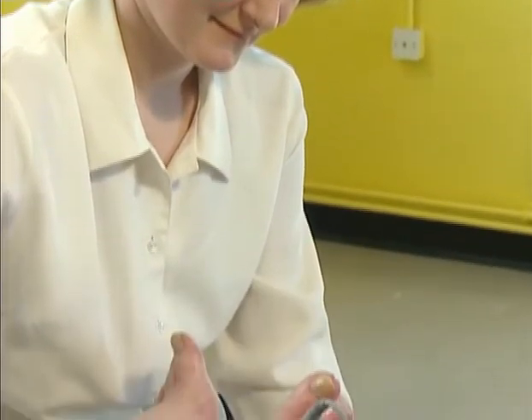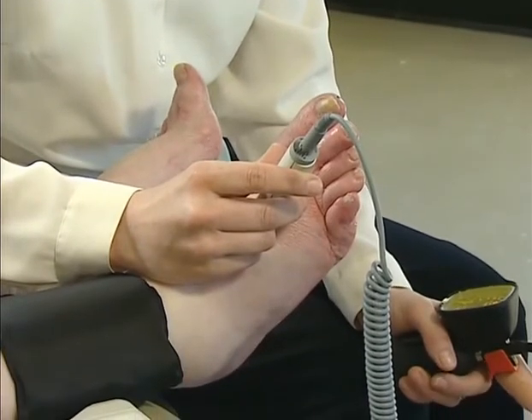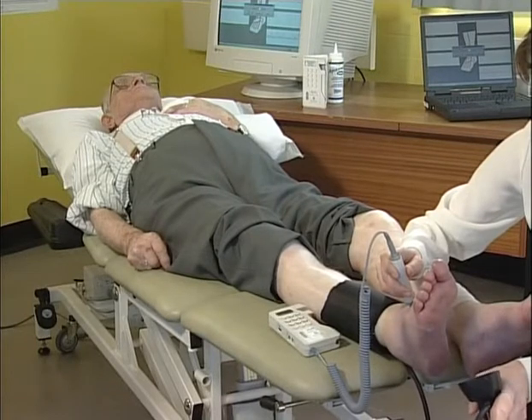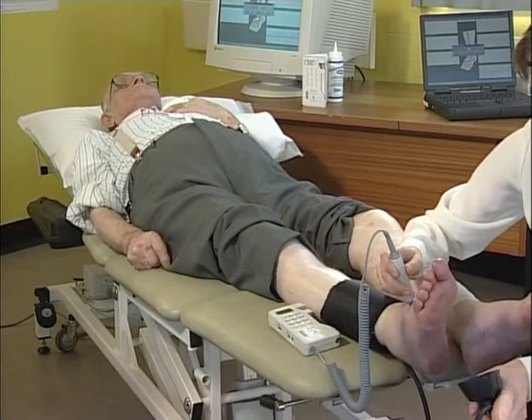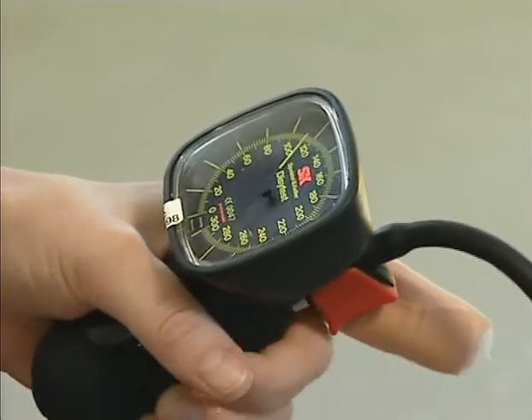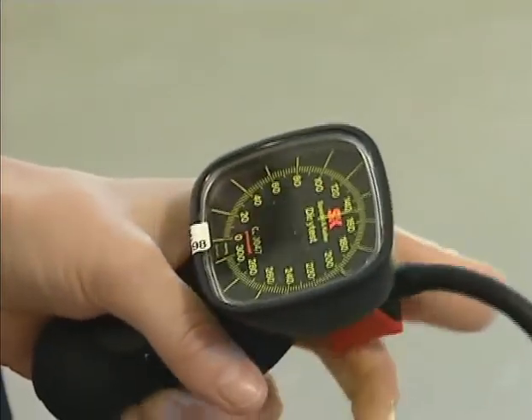Then the ankle systolic pressure is determined. The blood pressure cuff is placed around the leg, just above the ankle. The posterior tibial and dorsalis pedis pressures are measured, and the higher reading of the 2 is used to calculate the ABPI in that leg. If there is significant difference in pressures, arterial disease could be present.